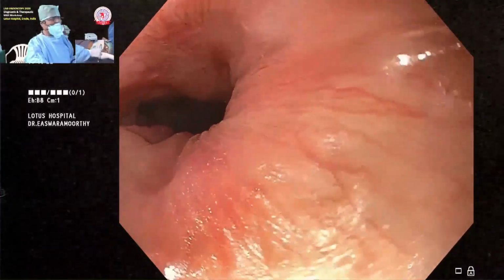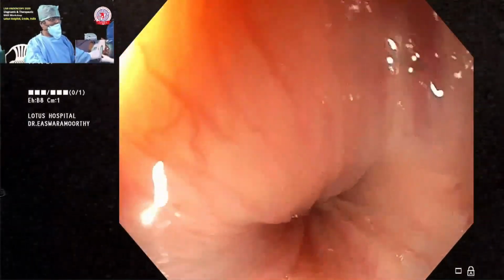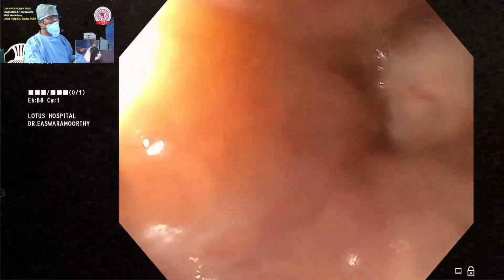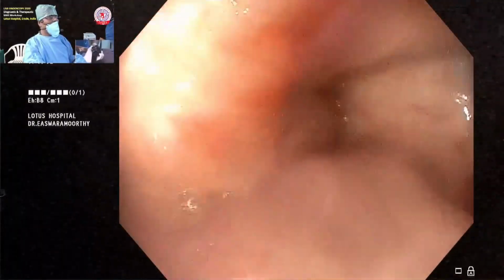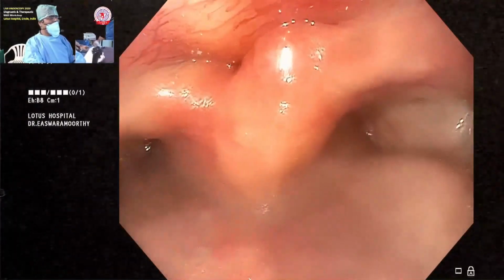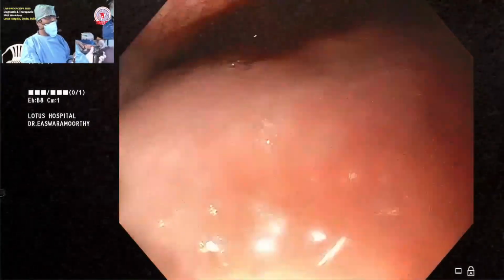Now for example, you are exactly at 15, so we are right at the cricopharynx. Big wheel towards me again. Whenever you have to see something, big wheel towards you. Remember that, that is well enough for this first module. Then you will be able to see the vocal cords again, and you have a glimpse. Don't leave it for the ENT people to diagnose the piriform fossa growth and vallecular growth, things like that.